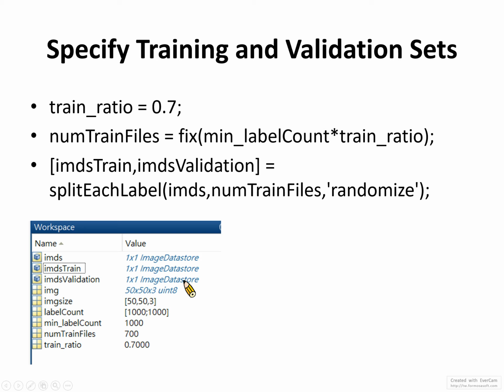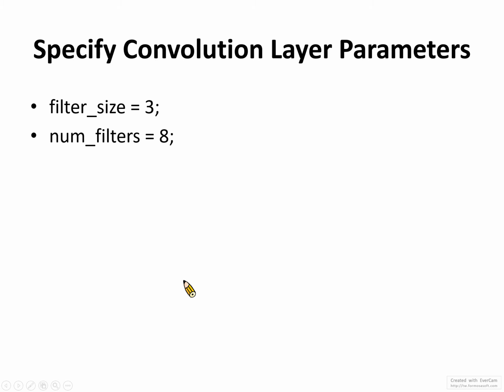Okay, so from now, we enter a very important step: preparing our data and knowing the size of our data. The next thing is that we need to build our convolutional neural network architectures. For simplification, I'll just follow the simple example here.